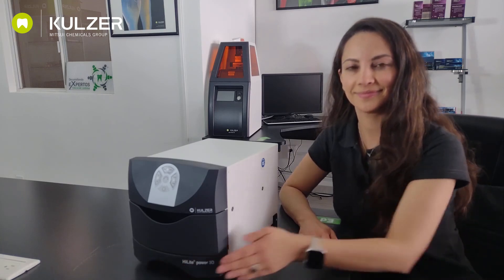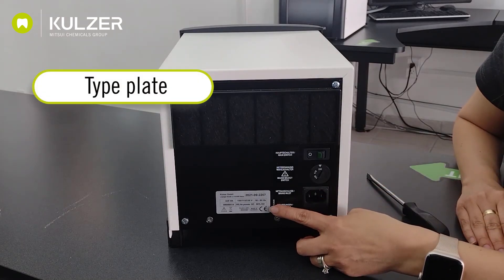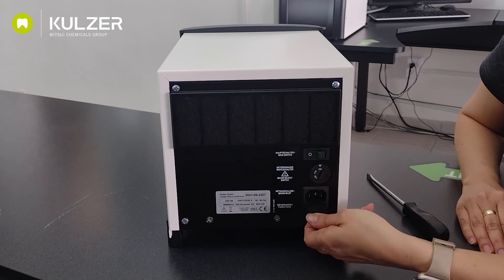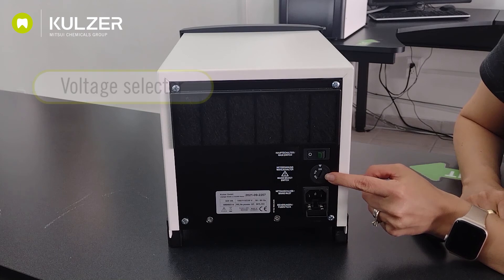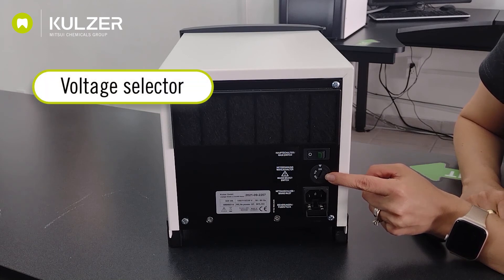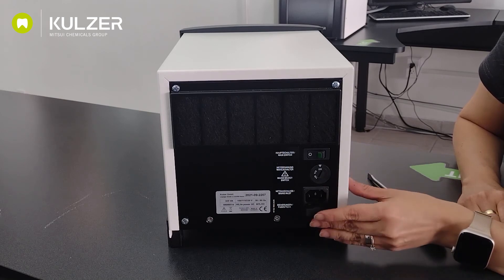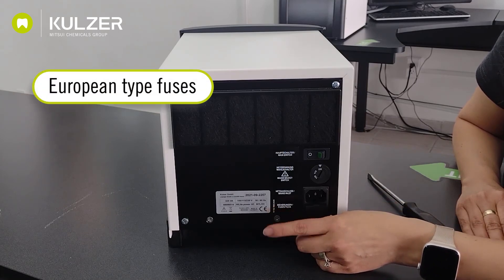This is the filter. This filter can be cleaned with pressurized air. This is the Highlight's type plate. Here we find, among other things, information about the type of fuse to be used. And this one is the fuse holder. Here we have the voltage selector. An important thing to know is the location of the fuses as well as their specs, which can be found on the type plate, as mentioned. The equipment uses European type fuses.